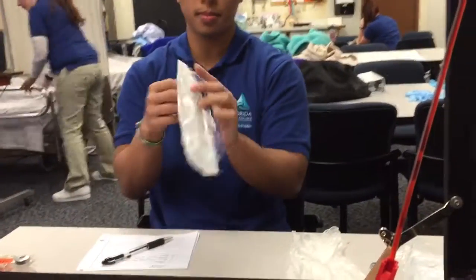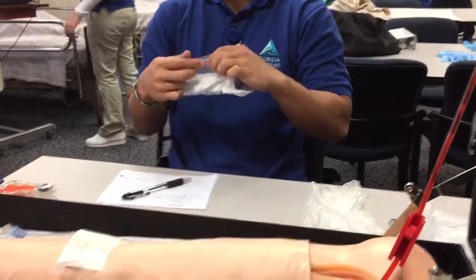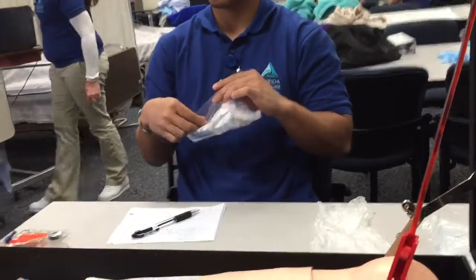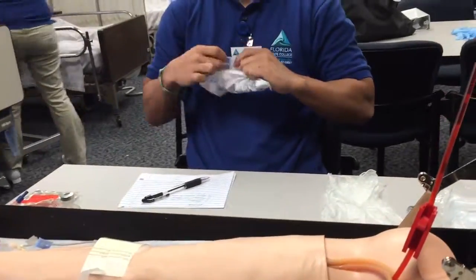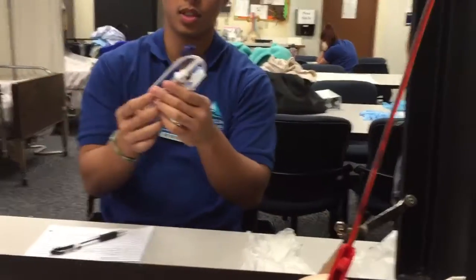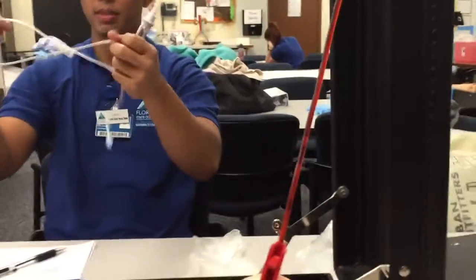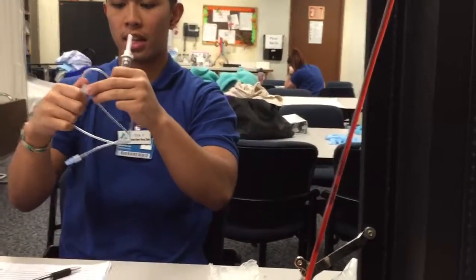So we're going to open this up. We're going to take this out. This is good to go. We're going to make sure this is clamped so that the antibiotic doesn't run out. That's good.